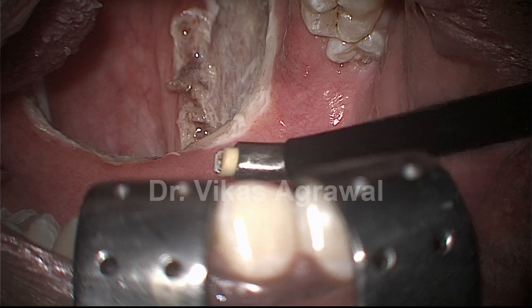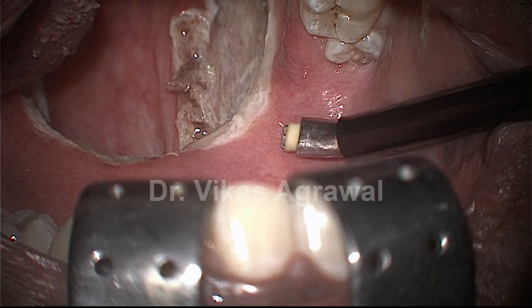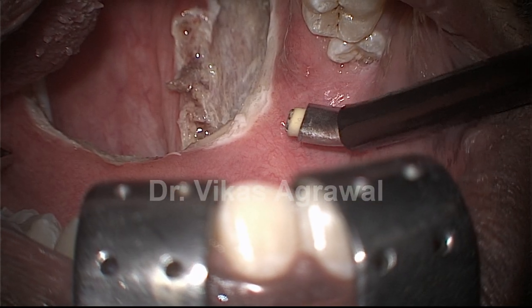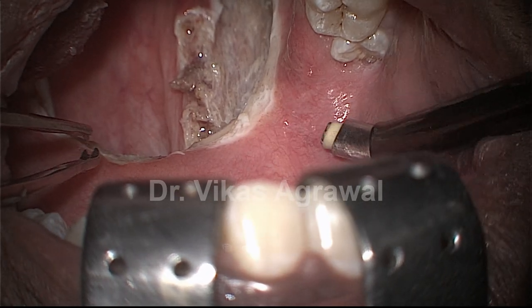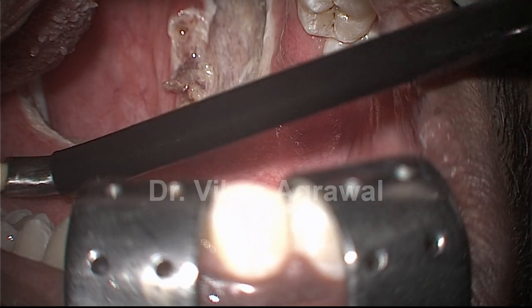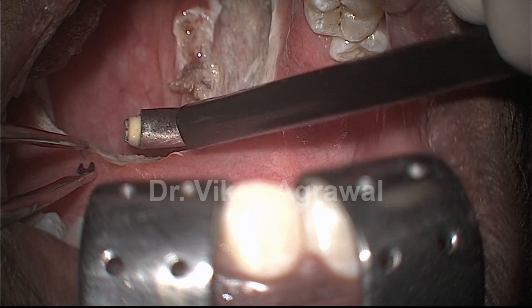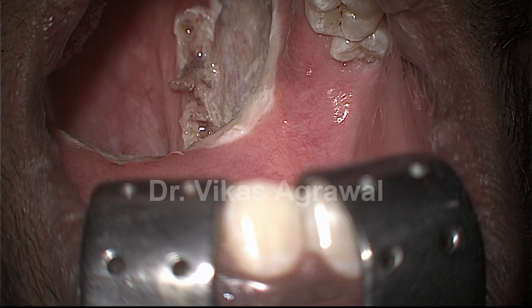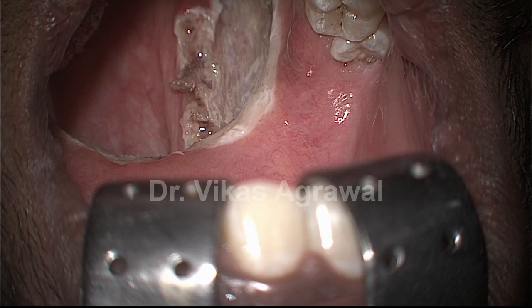It will pull the soft palate laterally, and then I will go across the midline along the soft palate from one pterygomandibular raphe to the other pterygomandibular raphe. That is the difference in my technique from other techniques — when you go across from one pterygomandibular raphe to the other, it forms a suspension bridge and will not let the soft palate fall. The lateral arm is the standard used in every other technique, so it will take care of both lateral as well as anteroposterior collapse.